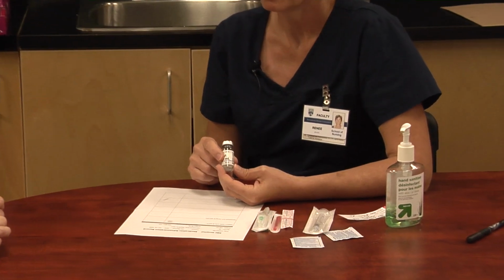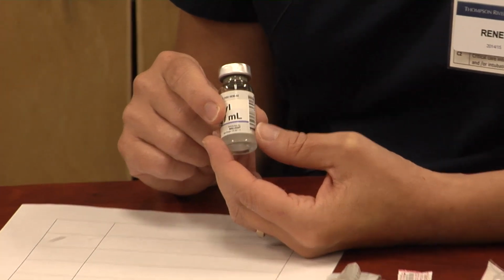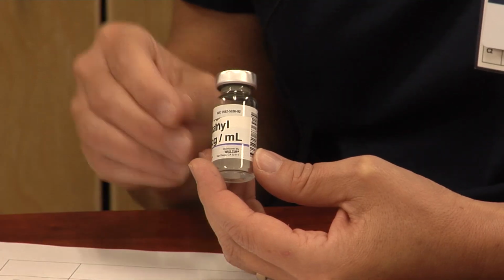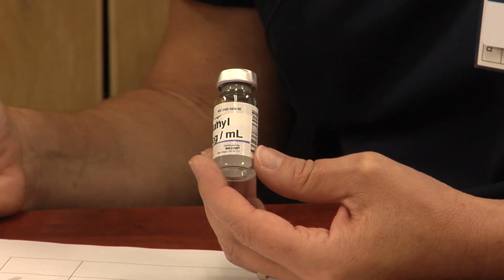So a vial is different than an ampule. It can be single dose. It can be multi-dose. Institutions try to provide us with single dose vials whenever possible, just from a patient safety point of view, less risk of contamination. Oh, for sure.